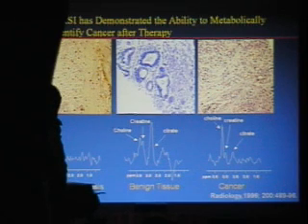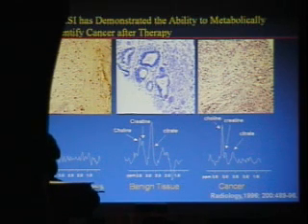So let's just talk a little bit more about prostates now. Spectroscopy has been used more and more frequently now. We're in the middle of a large multi-center trial to try to determine how useful it is. But going back quite a ways, this paper was in '96. This is from the group at UCSF, and John Kurhanewicz and Hedvig Hricak really pioneered most of this work.